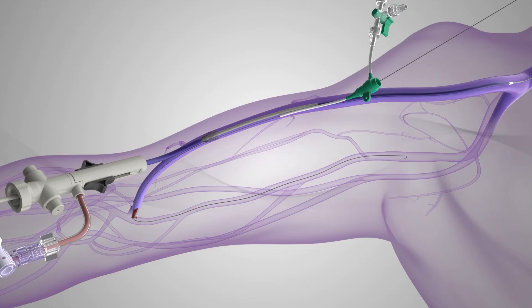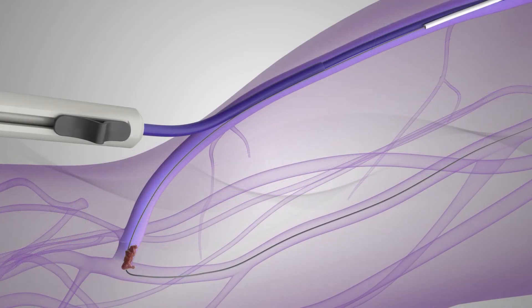The Inthril thrombectomy catheter is reintroduced into the Inthril sheath and advanced past the secondary arterial sheath. Then, the Inthril thrombectomy catheter element is deployed, the Inthril sheath funnel is recaptured, and standard techniques are used to remove the arterial plug.